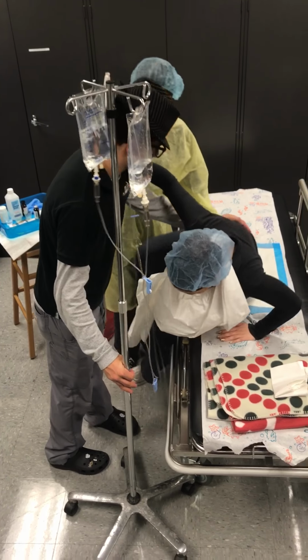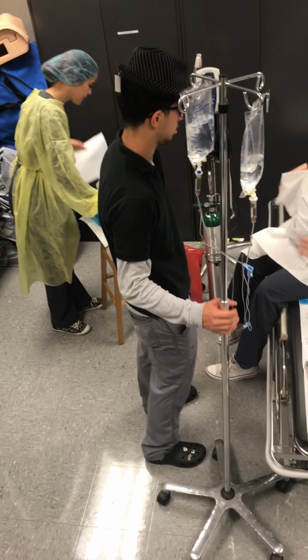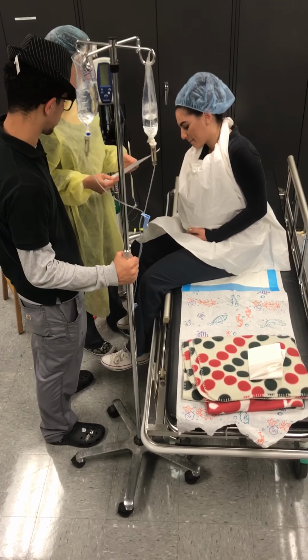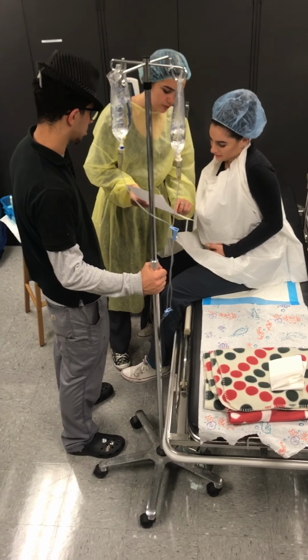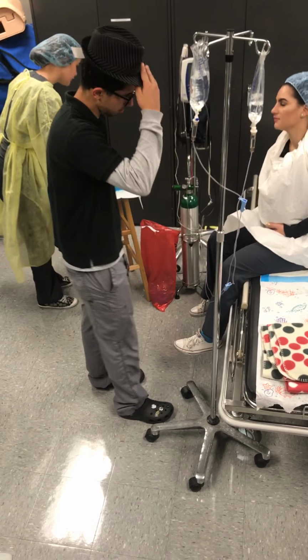Verify the patient's signature on the informed consent. Can you verify your date of birth for me, please? February 15th. And the last four numbers of your social? 567. Okay. Is this your signature right here at the bottom of the informed consent? Yes. Okay. If the patient has any questions: do you have any further questions?